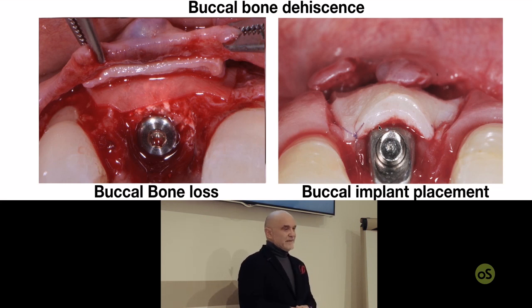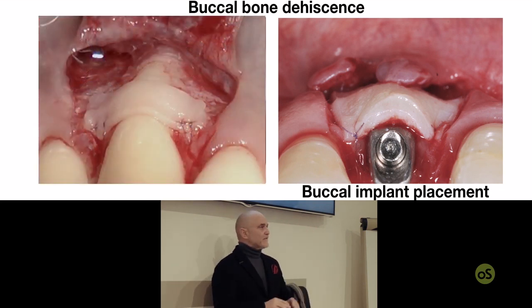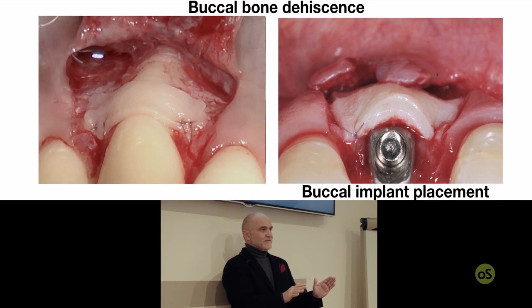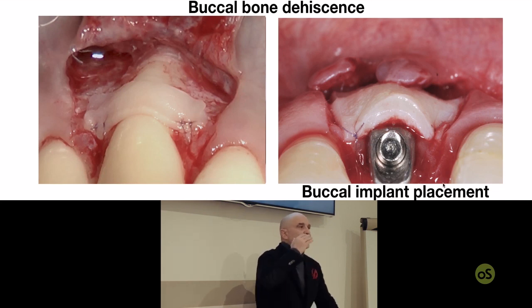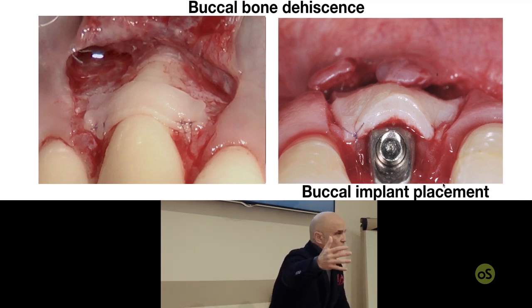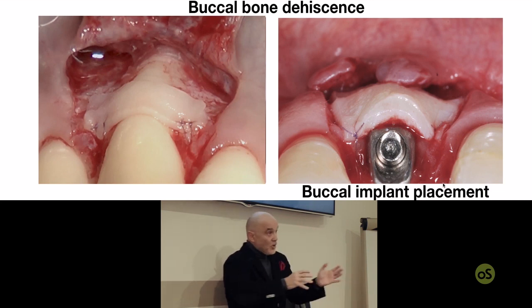What we do in the treatment of gingival recession around the implant due to bad implant installation is exactly the same treatment we did for treatment of gingival recession around teeth, where the root, like the implant, is placed so buccally outside of the bone that the only way to treat is by soft tissue grafting and not hard tissue grafting.